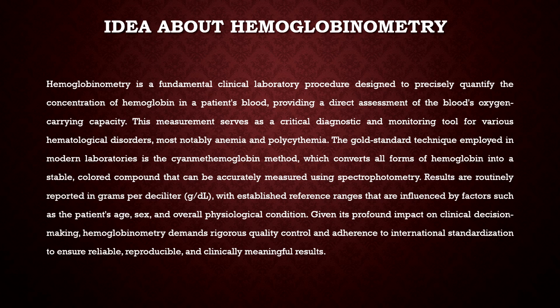And if we can clinically identify the amount of hemoglobin in a patient's blood, then we can also assess the amount of oxygen that is carried by that amount of hemoglobin. So this measurement serves as a clinical diagnostic and monitoring tool for various hematological disorders.